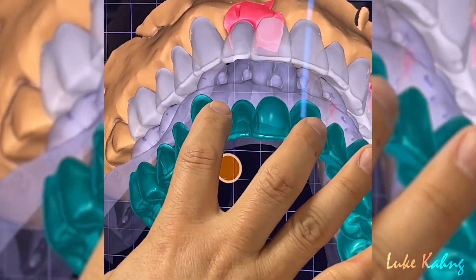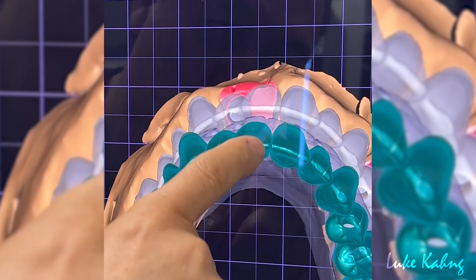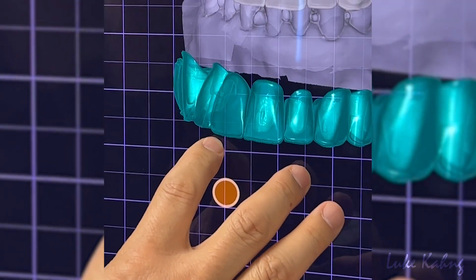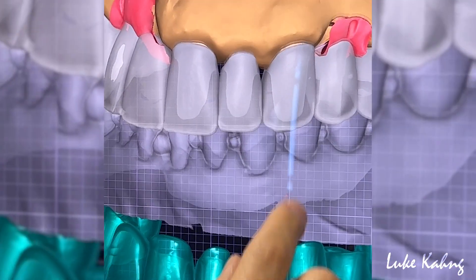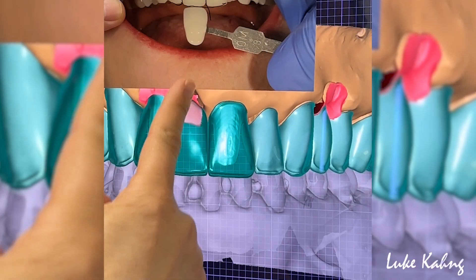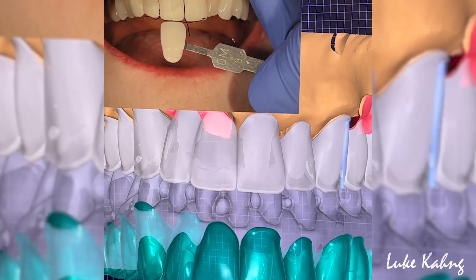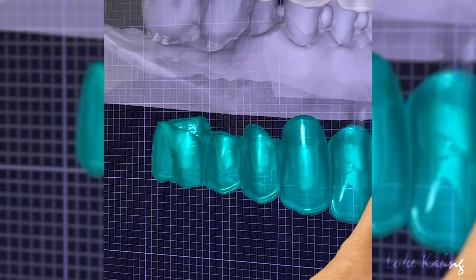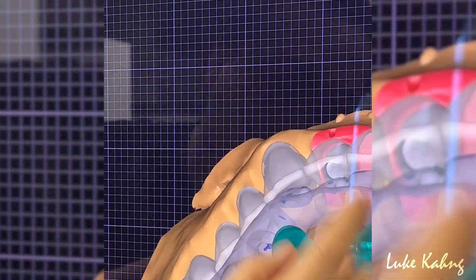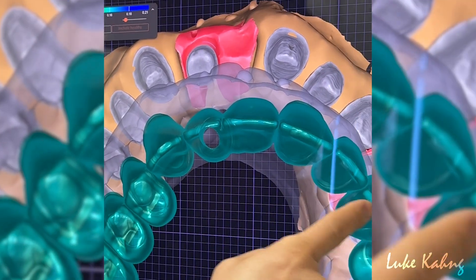So this is the preparation types. Full mouth case. I like the joint here. I like the cut-back just a little bit, so inside your tip is thicker, which is great. We move to midline — just a little bit slightly, very little. And then we finish the final full mouth combo case. It's great occlusion contact. I really like here. I really like the alignment, occlusion contact.